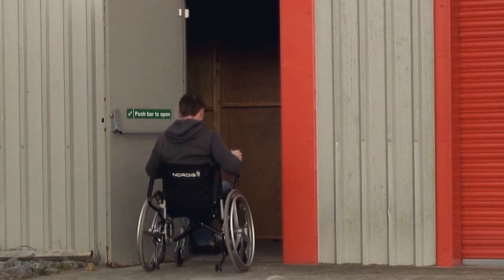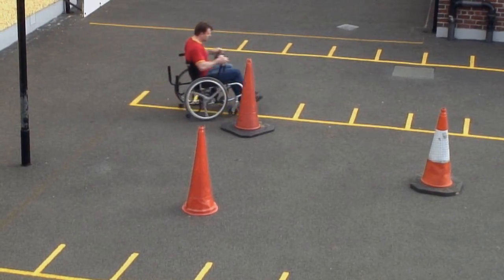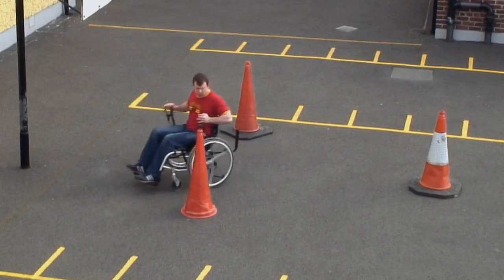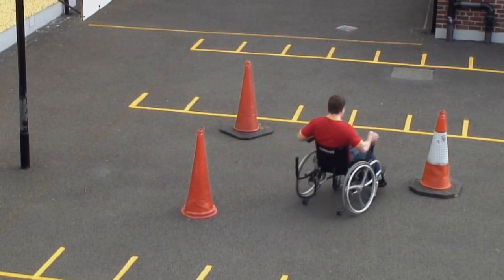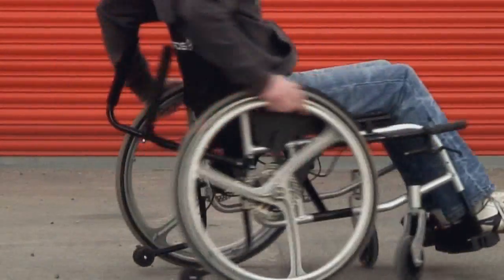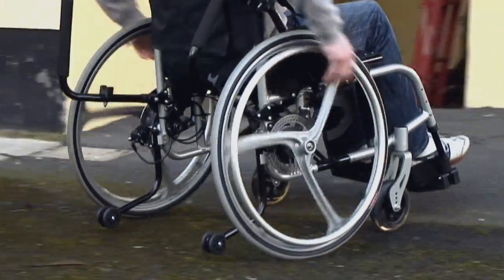The Nordigo wheelchair loses no maneuverability over a standard wheelchair. It can be used indoors as easily as it can be used outdoors. Each wheel can be controlled individually by pushing on the lever or using the independent brakes. Steering is achieved by either braking or a combination of both pushing and braking on opposite sides. When using the Nordigo indoors, the user can switch back to using standard rims for propulsion. Just let go of the Nordigo levers and it's ready to be pushed using the rims.